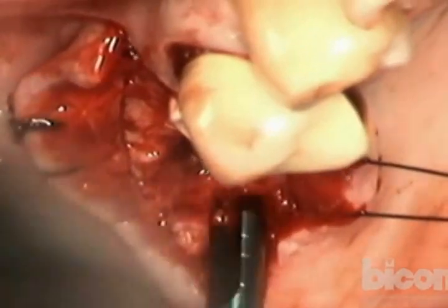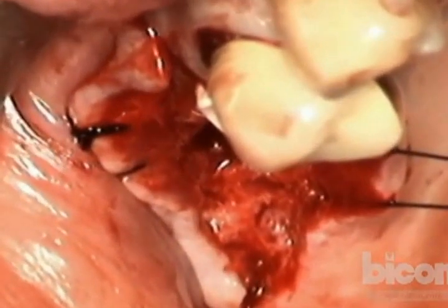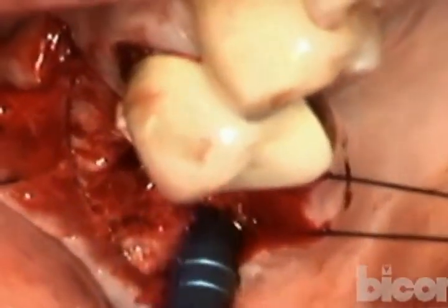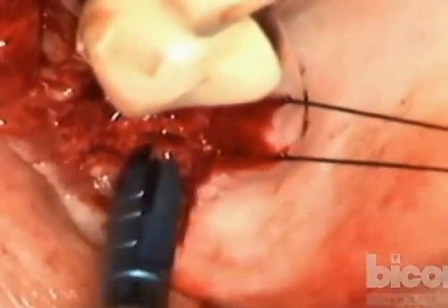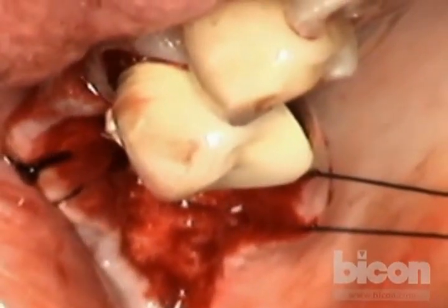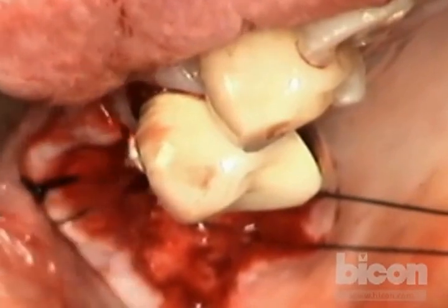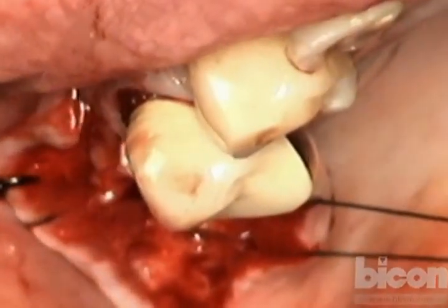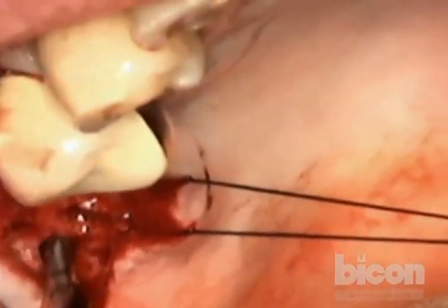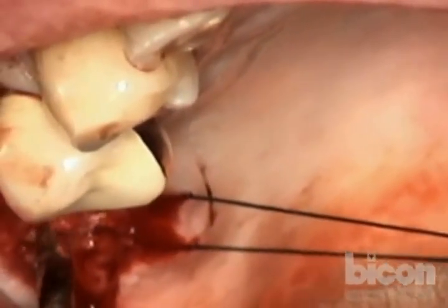Okay, what I don't like here is the window wasn't as... Okay, because of the bone thickness, the osteotomy is going more toward the palatal. So we will correct that by making a secondary osteotomy more mesial and buccal and joining the two. When you're not drilling at high speed, you can maneuver a lot of things to your advantage.